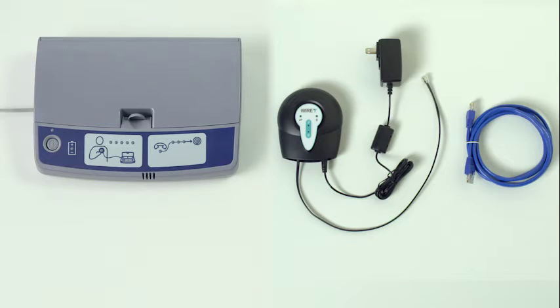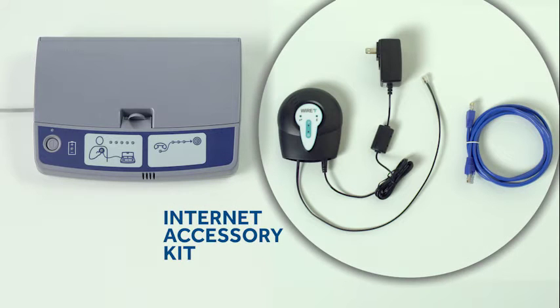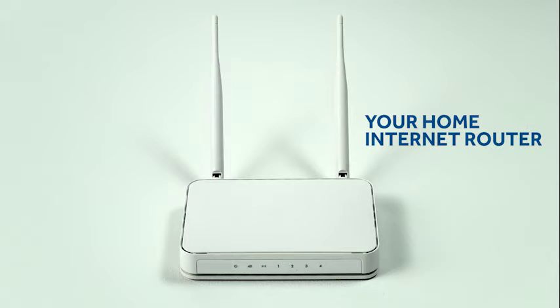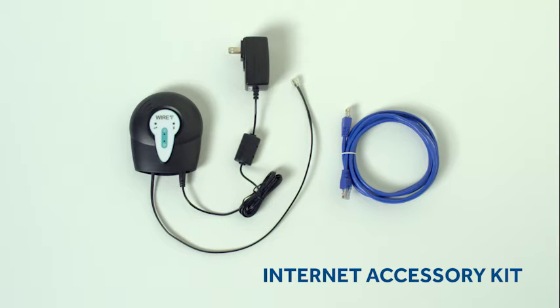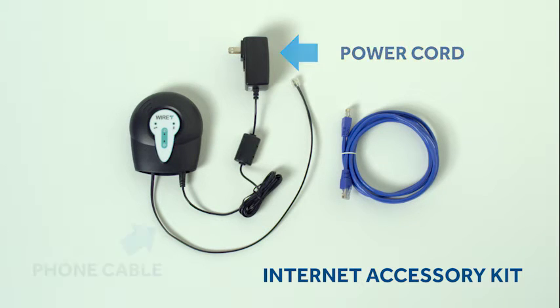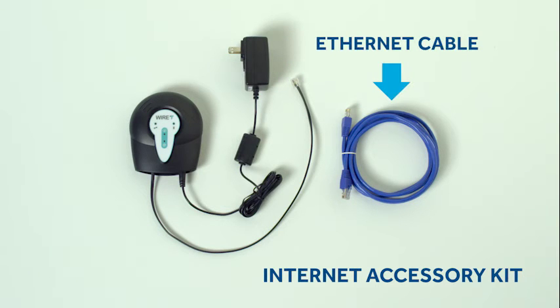We'll be working with these components: an internet accessory kit, your home internet router, and your CareLink monitor. The kit includes an internet accessory, a power cord for the accessory, a short phone cable, and an ethernet cable.